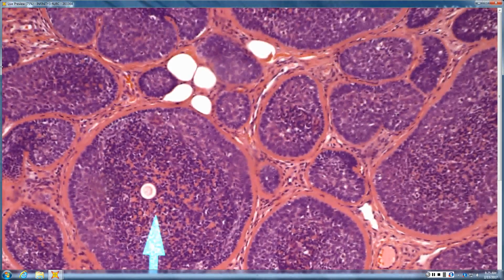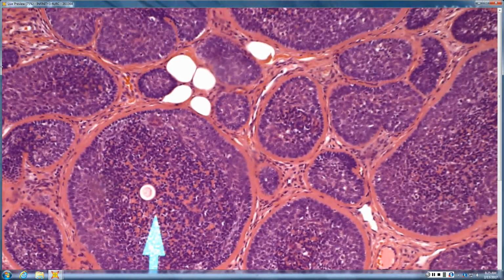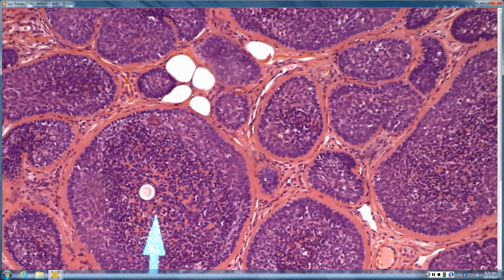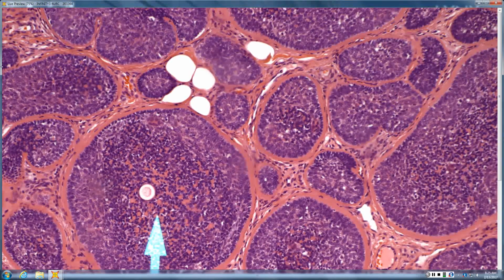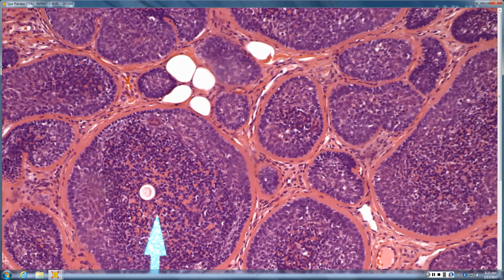Let's see. Blue tumor with little areas of red. No, I was looking for lymphocytes. If there were lots of lymphocytes, then you would think of a spiroadenoma, and if it's more jigsaw puzzle with surrounding basal membrane zone, then you're thinking cylindroma, and they're variants of the same tumor.